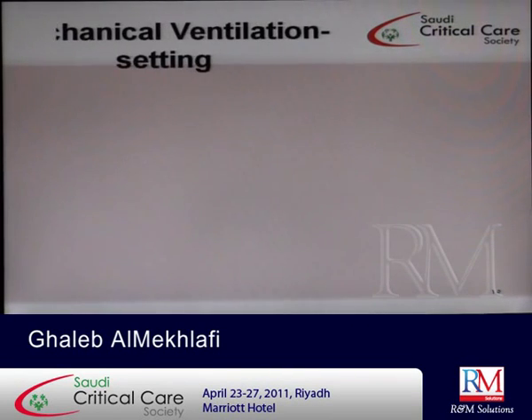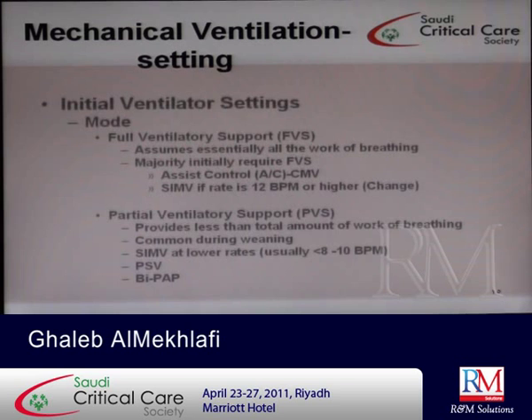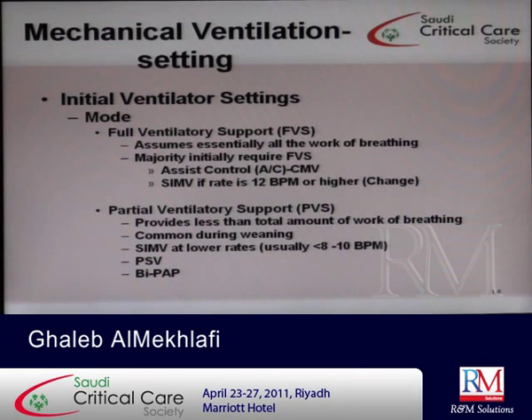Okay, now once you have decided that this patient needs mechanical ventilation, you have to do what? You have to do the setting of ventilation and also the setting of security or alarms. Now, setting of ventilation, you first choose what? The mode. And the mode is chosen according to what type of support you need.